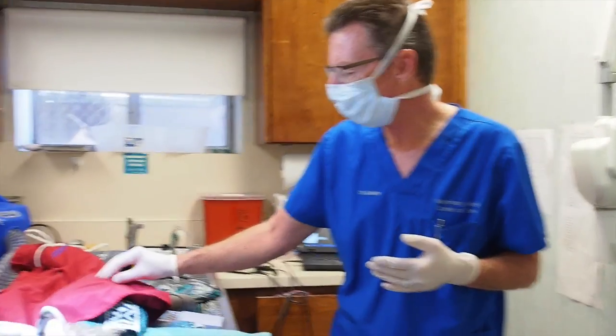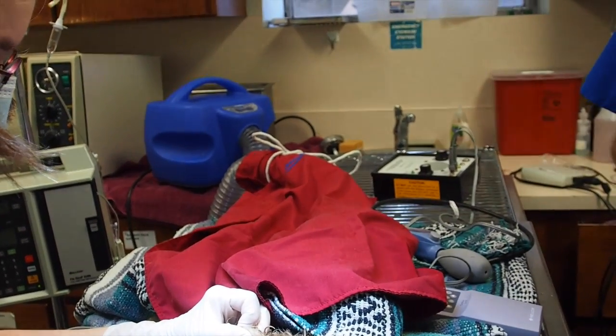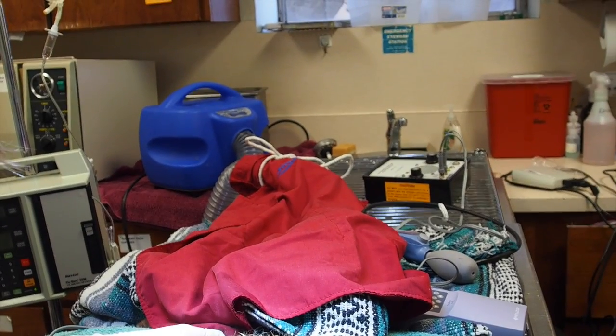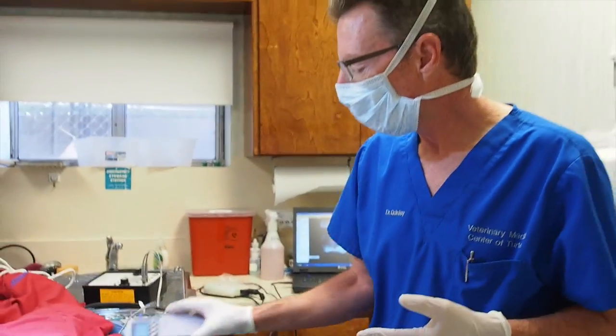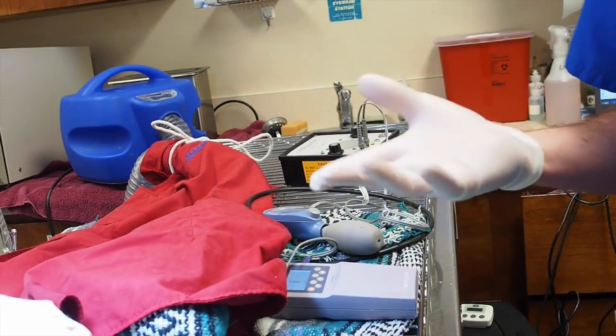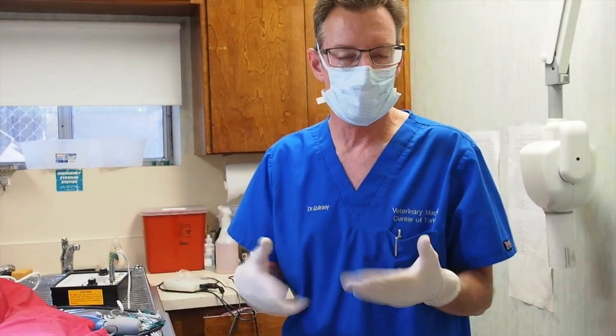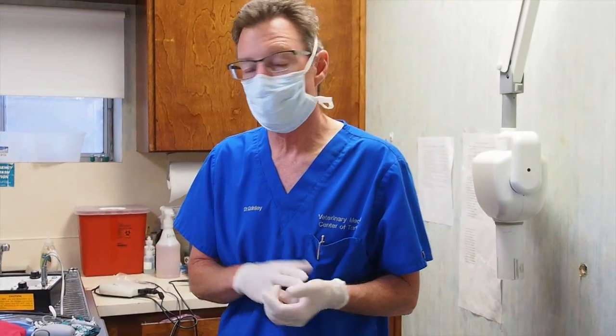Because we do it under anesthesia, we also take a lot of efforts. This is actually a warm air blanket that keeps them warm, because getting a cold body core temperature is a problem with anesthesia. It's off right now because it makes too much noise for the little video I'm doing. We monitor blood pressure with this. We monitor pulse oximetry, the amount of oxygen that's in the bloodstream, and we have a monitor that tells us if the respiration is normal. We take the vital signs and the blood pressure every 5 to 10 minutes, depending on how stable they are.